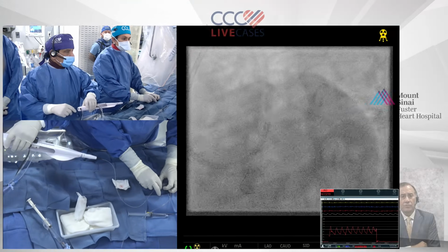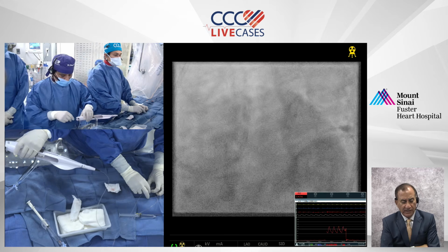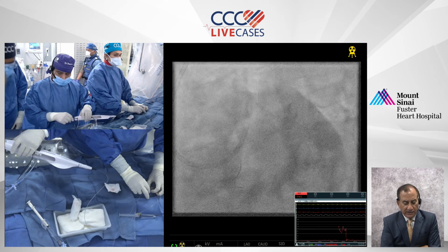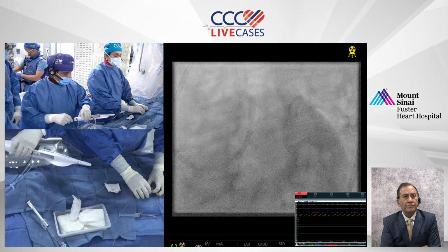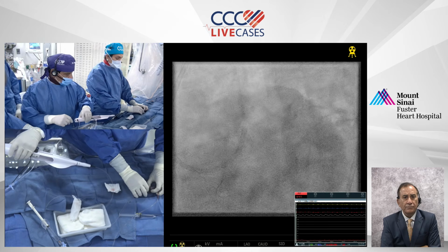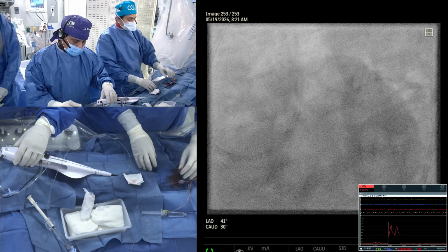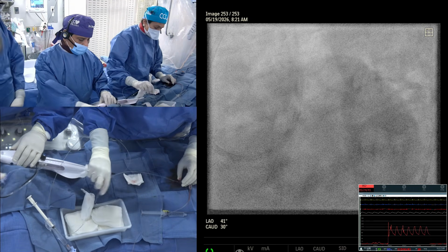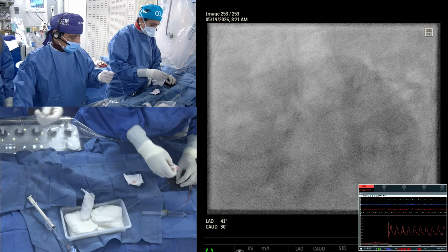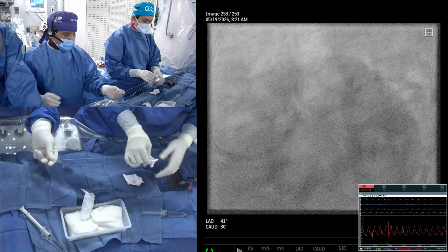Anu, a question for you. I'm not able to know who's the person asking. Considering the ostial lesion, any role for the rota ES wire? Extra support, yeah. Nothing. I mean, here, if you see most of the disease was in ostial LAD. Yeah, if somebody says I want to do extra support wire, that's okay too. But we use rota floppy. Yeah. So extra support mostly, wire.